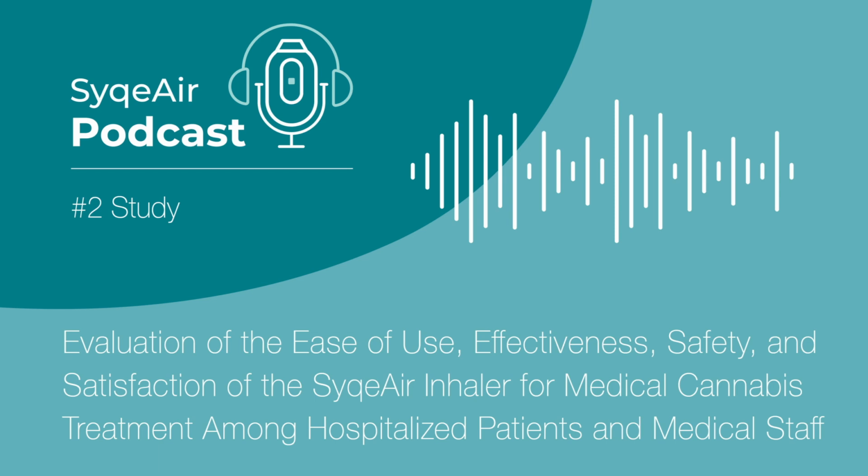It introduces us to the SyqeAir inhaler, which is a novel metered dose inhaler. Think of it as a high-tech way to ensure that patients are receiving a consistent and reliable dose of cannabis medications. Now you've got my attention. So how does this inhaler actually work? Does it use cannabis oil? Actually, it uses the cannabis flower itself, but in a very controlled way. The SyqeAir inhaler has preloaded cartridges that contain a specific amount of cannabis flower, and that ensures that each dose is uniform and minimizes the variability that we see with other methods. So it takes the guesswork out of dosing. Exactly. This makes it much easier for doctors to manage treatment and monitor its effects.